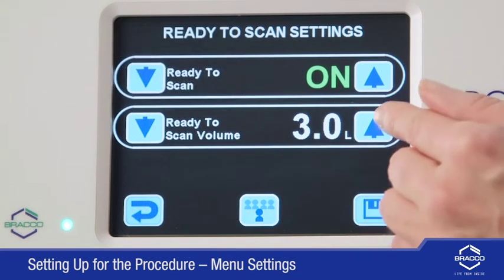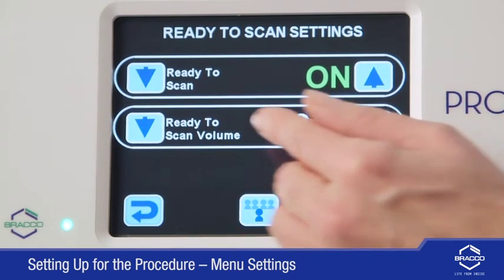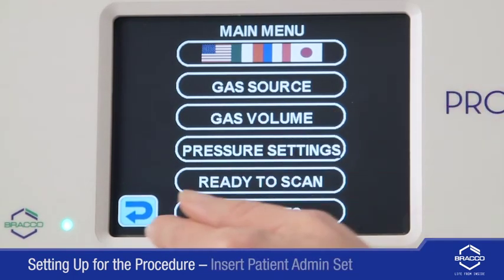When active, select the gas volume. The selected volume can either be set for one patient or all patients. If you want to retain the settings for one procedure, select the single patient icon at the bottom of the screen. After the procedure, the device will revert back to the previous settings. Press the Save icon in the lower right corner to store the selection.